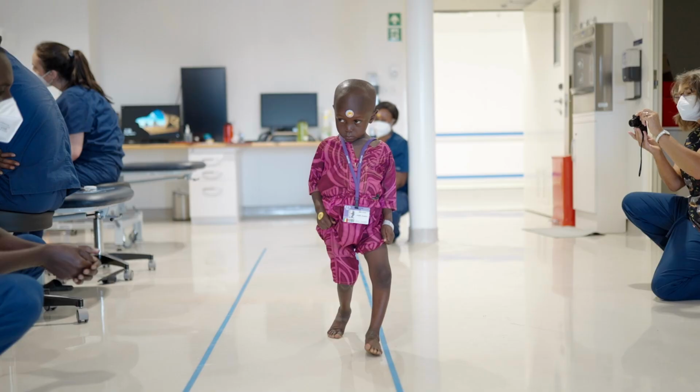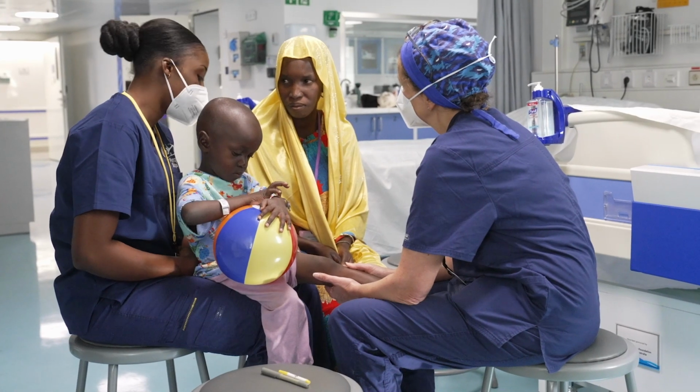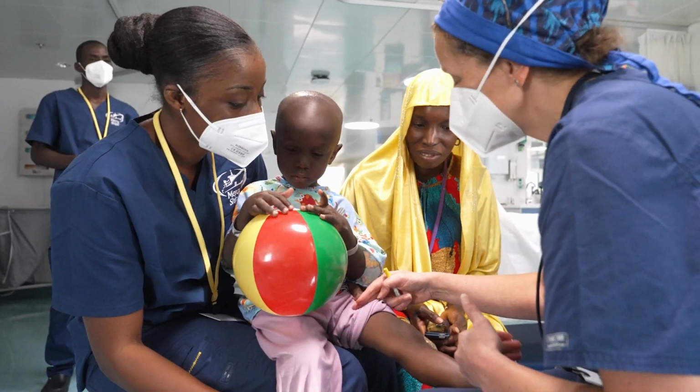There are people that are born with birth defects, like crooked legs, for example, that get corrected. The critical care cases that go to the ICU and then maybe need a ventilator are from the surgeries that they do. So maybe they come out and have swollen airways after the surgeries and need to stay on the ventilator for longer, or there has been an issue and they have to stay under anesthesia for longer. And this is then when they are put on our ventilators in the critical care unit.